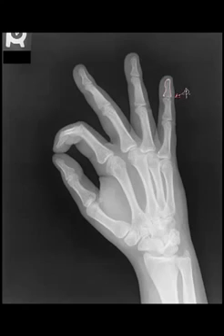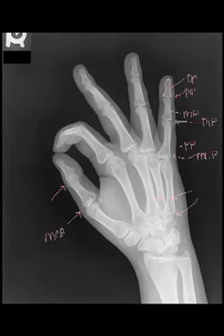Here's the distal interphalangeal joint, which makes this the distal phalanx, middle phalanx, proximal interphalangeal joint, proximal phalanx, metacarpophalangeal joint, carpometacarpal articulation, and of course the metacarpals. Then the interphalangeal joint of the thumb, the metacarpophalangeal joint of the thumb, and again the carpometacarpal joint. Again, carpals: scaphoid, lunate, triquetrum, and pisiform. Distal row: trapezium, trapezoid, capitate, hamate. And the hamate has this nice little hook here. Ulna, ulnar styloid, radial styloid, radiocarpal joint.